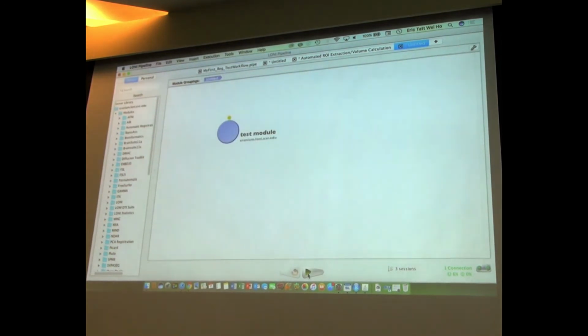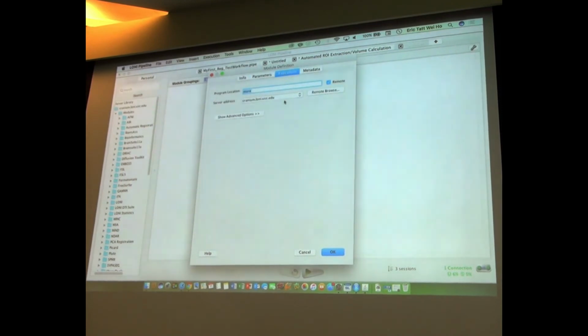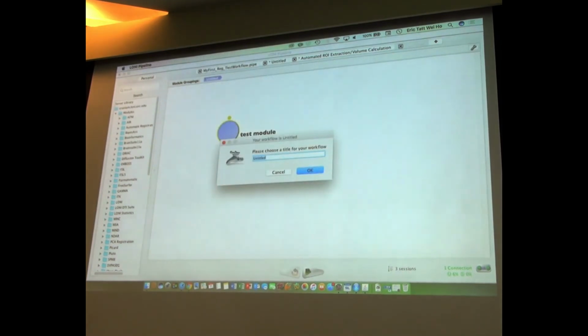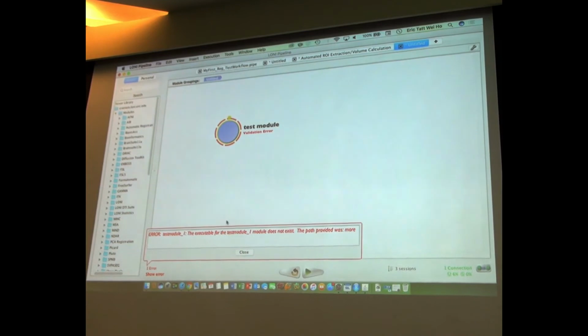Let me run this. Okay, so hold on one second. Let's make sure this runs locally, because at execution, oh no, I want it to run on the server. That's fine. Okay, so let's try that. So what's happening here, you guys, is I'm doing something slightly silly. I'm trying to grab a local file, send it to the server, and then I'm trying to see the content from the server. It's not happy. Why?